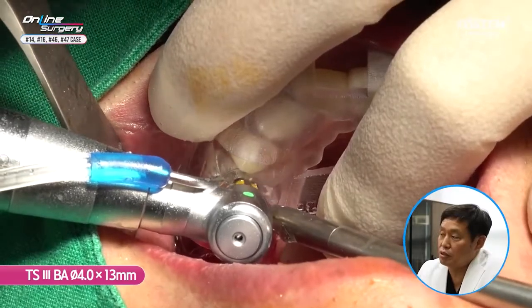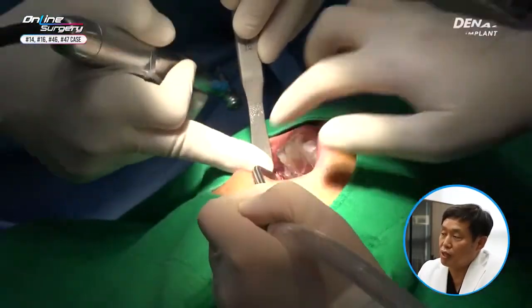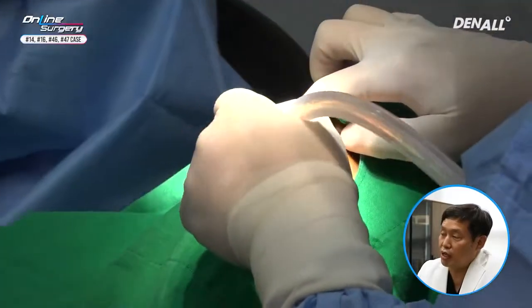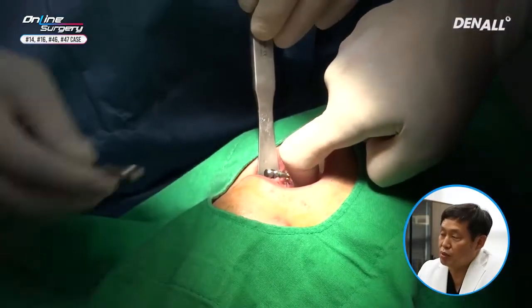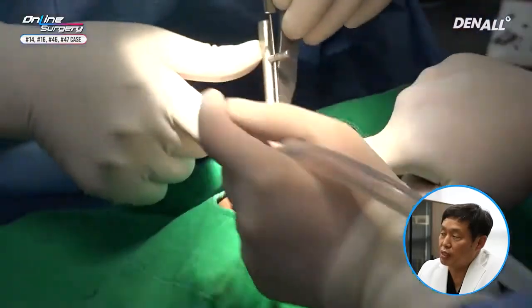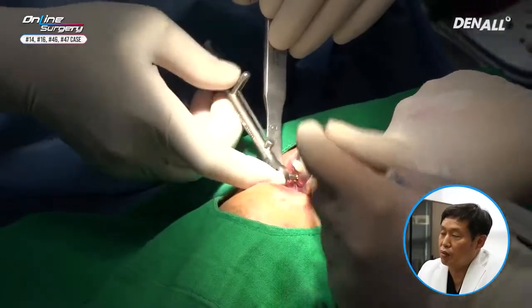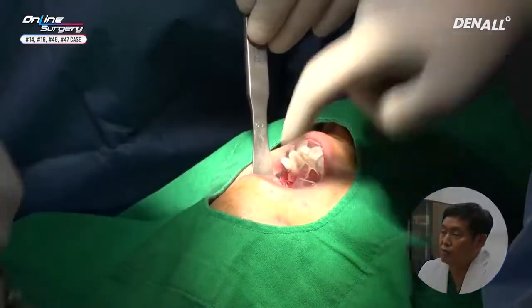As I did drilling, I could really feel that the stability would not be good. After placing number 16, this will be adjusted once again. With a torque wrench, you can see that primary stability is barely secured. After removing template, I'm going to remove the implant and check once again.